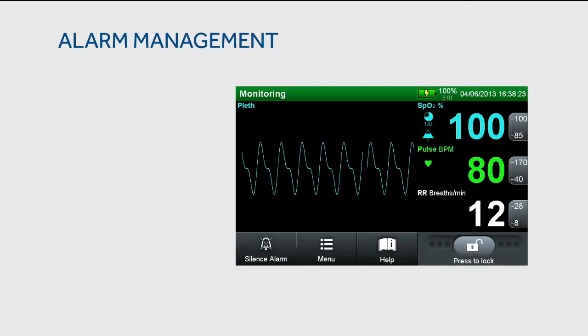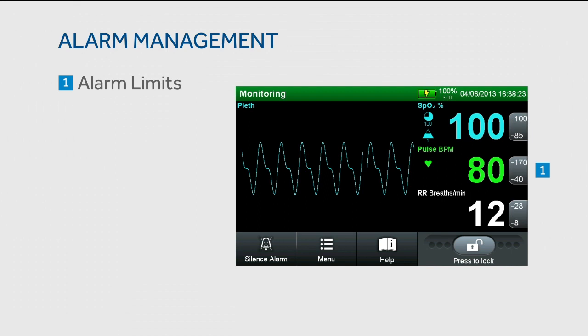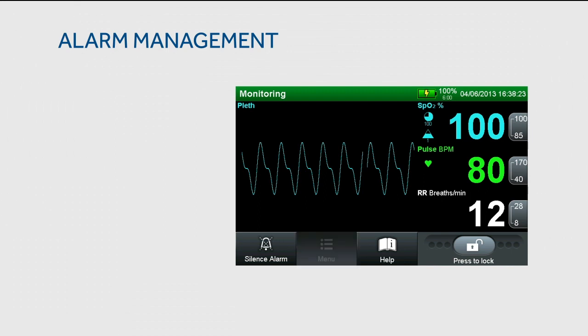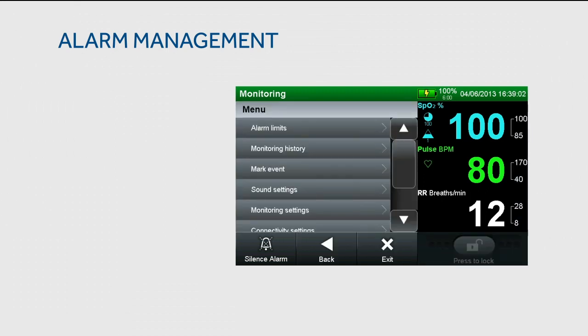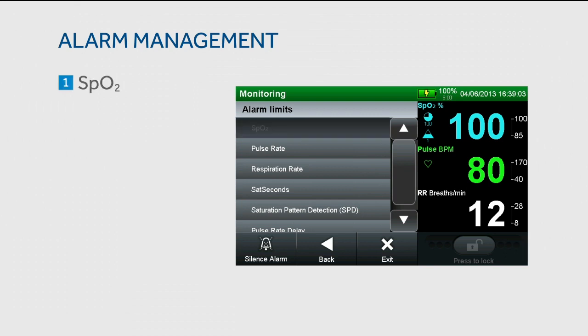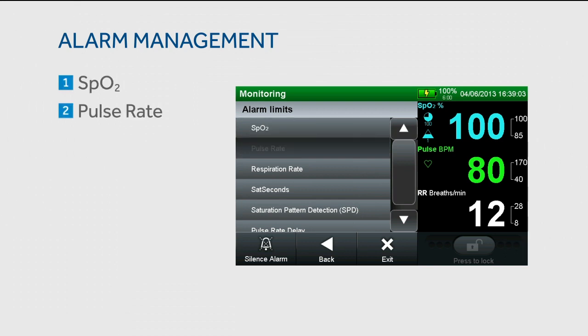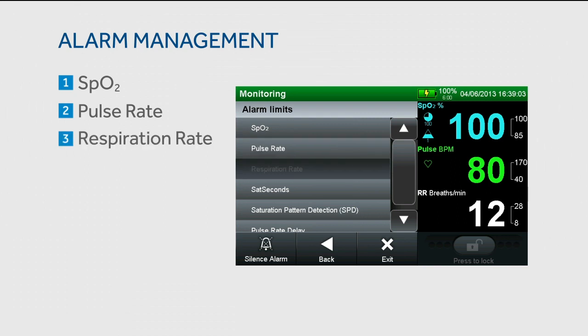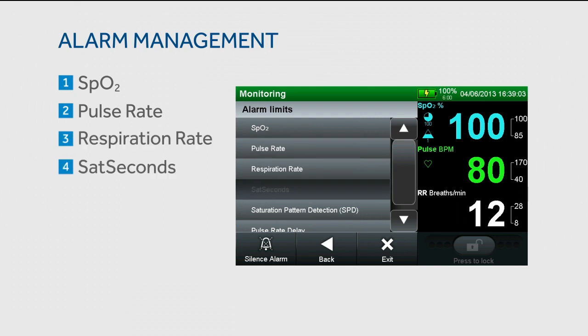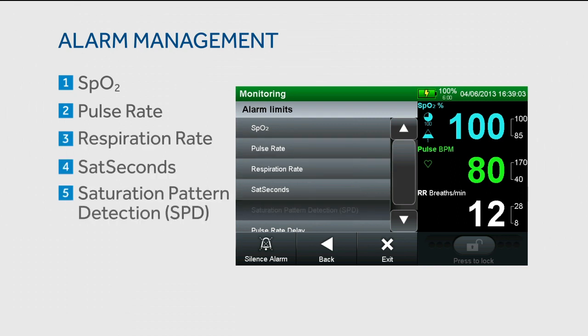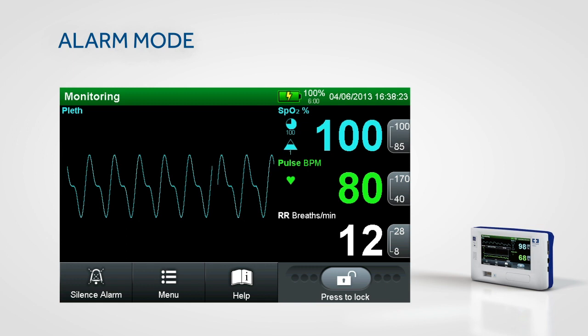To access the alarm limits, touch the limit range or navigate to the menu and select the alarm limits submenu. From this menu, you can adjust the alarm limits for SpO2, pulse rate, respiration rate, SAT seconds, and saturation pattern detection.